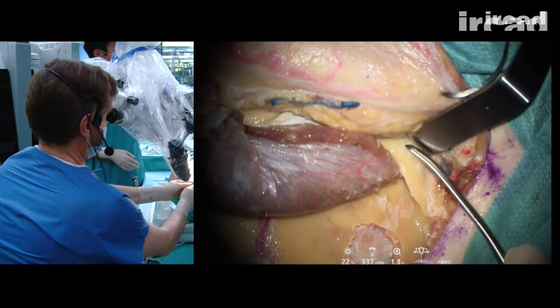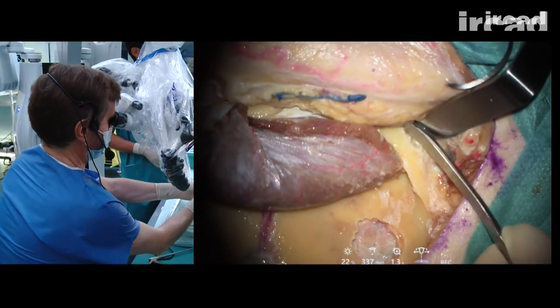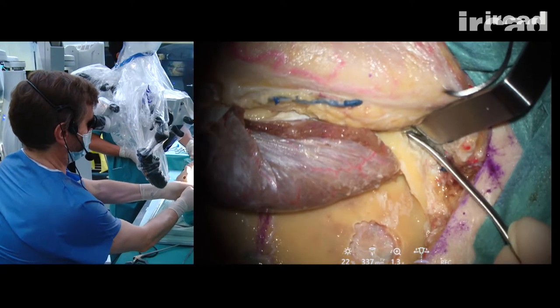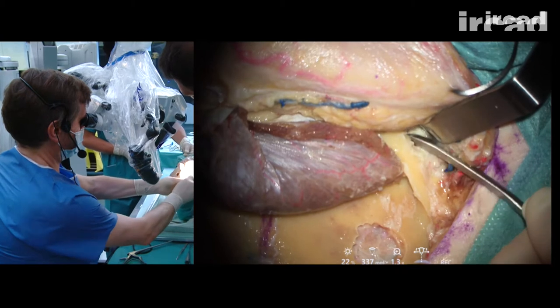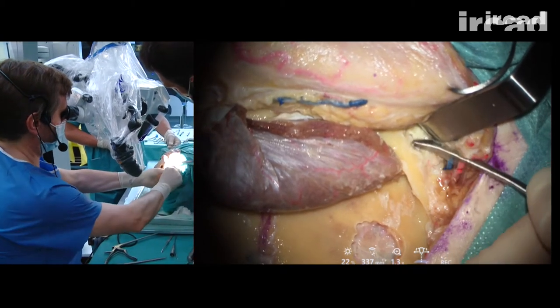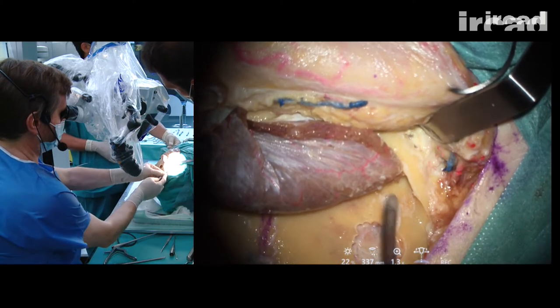So here, tirez un peu plus, Lorenzo. We need to expose the posterior aspect of the zygoma and to detach a little bit the masseter muscle fibers.